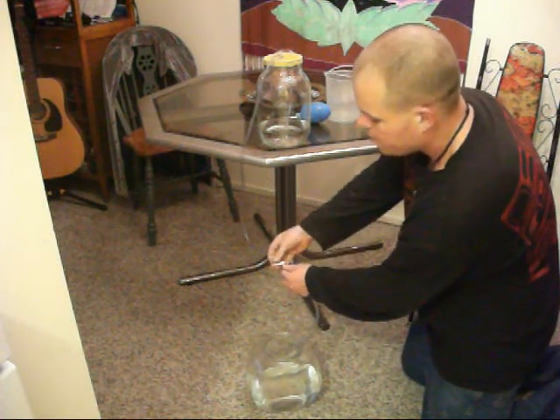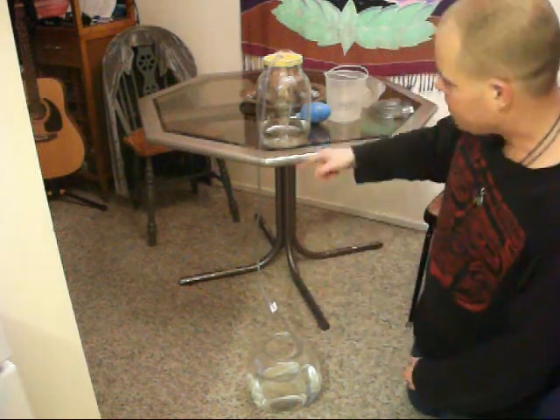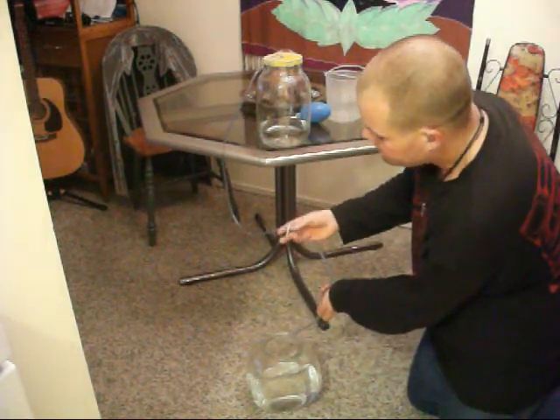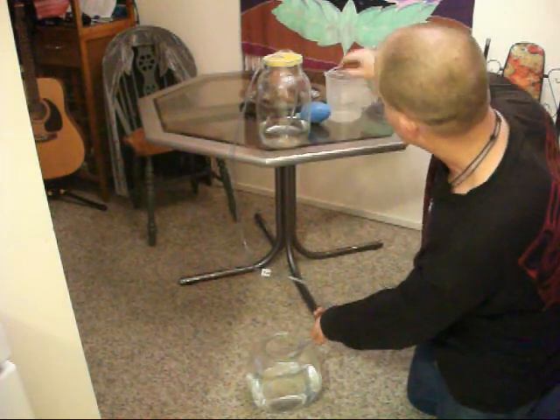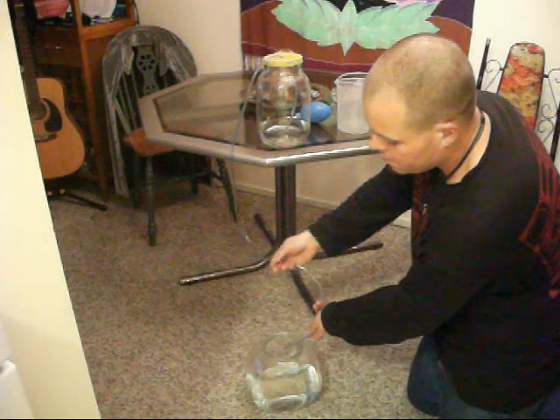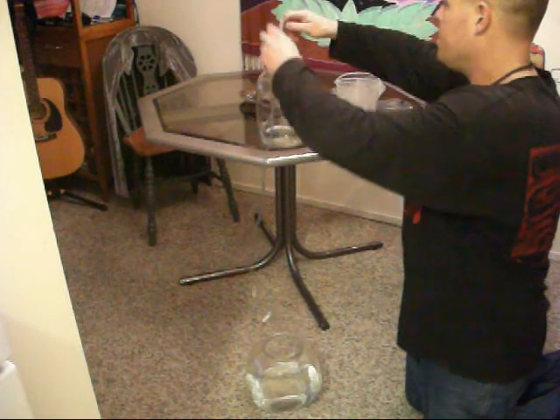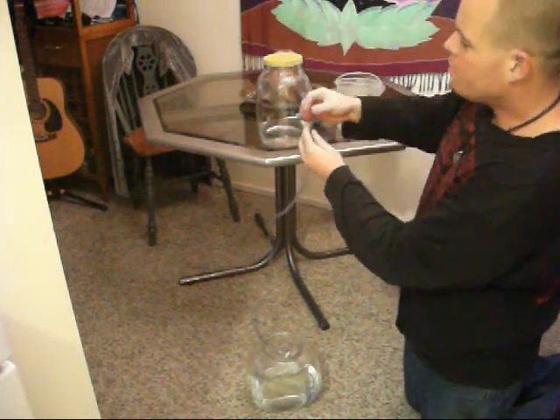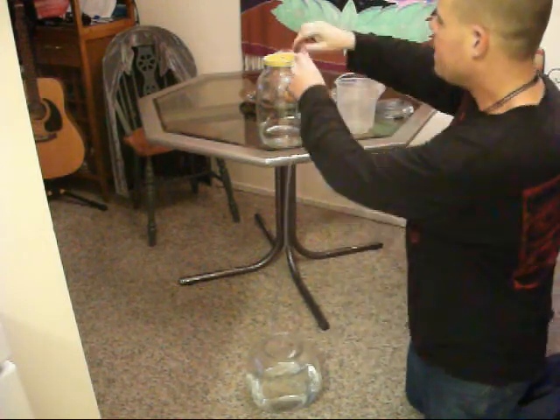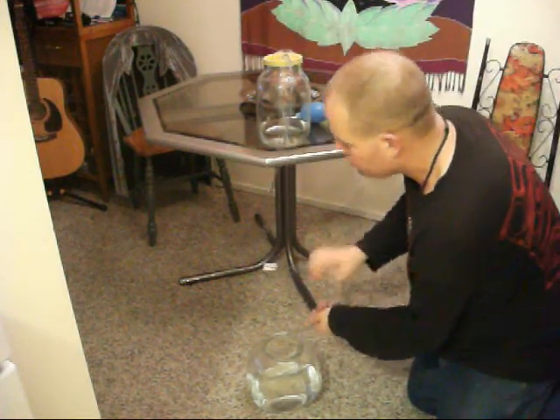This is for demonstration purposes to show you that it goes down. You see the water rose down a level there. It turns on and it goes. Now if this tube is empty, and there's no liquid in there, you've got to get the liquid through there first, either by running it in a tap, like this. This is the homemade version. You run this in the tap and open that and then close it, so all the water is trapped inside, and that's what allows the gravity to act as a siphon. So you can also do it in reverse like this.